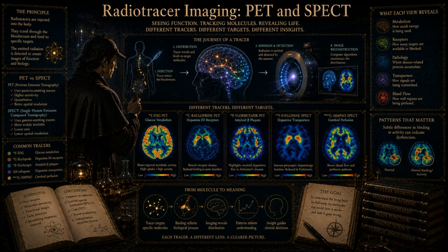And what happens when you do this protocol in patients with schizophrenia compared to healthy controls? The results are striking, highly replicated, and fundamentally altered our understanding of the disease. When you give amphetamine to healthy controls, you see a predictable, moderate level of tracer displacement. But when you give the exact same weight-adjusted dose of amphetamine to patients with schizophrenia, or even to prodromal patients who are just showing early signs of being at high risk for psychosis, you see significantly greater dopamine release. The delta BPND drop is much, much larger. Their presynaptic engines are hyperreactive.